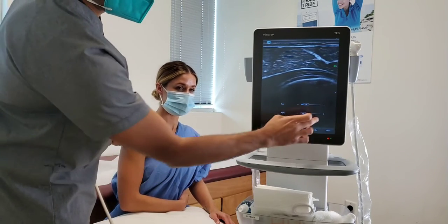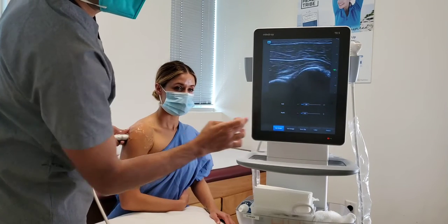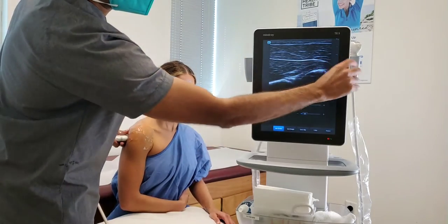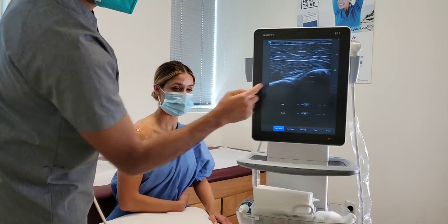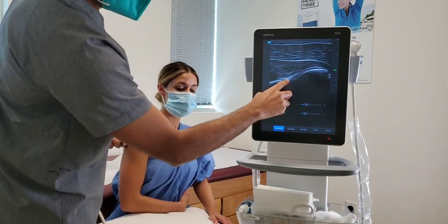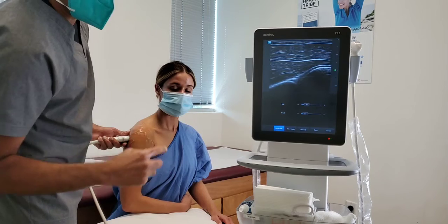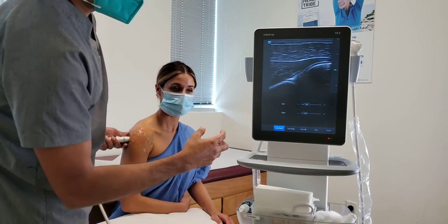And then as we go further, we can see the back of the shoulder joint right over here. So this is the ball of the ball and socket. This is the infraspinatus tendon or muscle that goes into the tendon and attaches over there. This is the end of the shoulder blade, which is actually the socket of the ball and socket joint. And this triangle right here is what's called the labrum. The labrum is that gasket or that thick rubber band that surrounds the ball and socket joint and provides stability to the ball and socket.